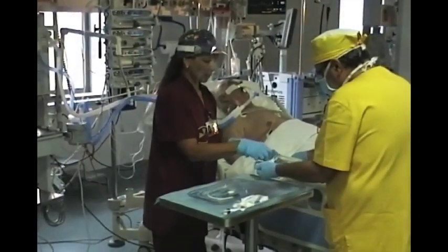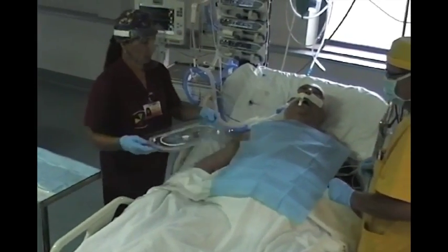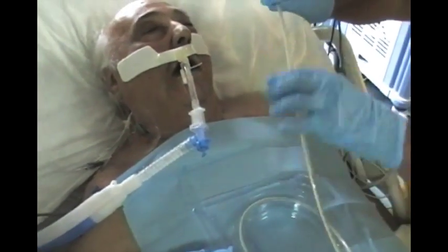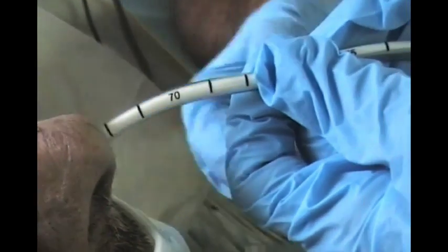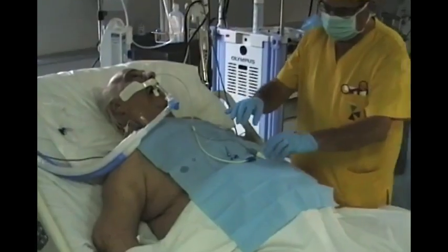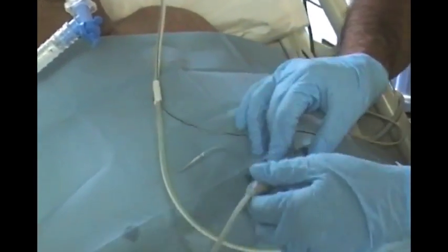And we should put some lubricant for easier insertion. It's put directly through the nose, like an NG tube. And then we should connect the adapter to the ventilator.